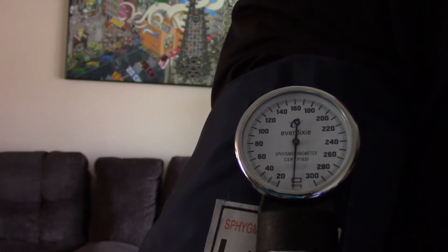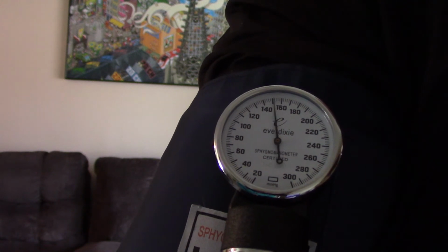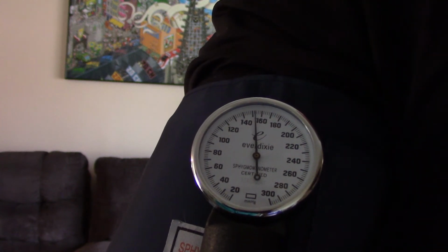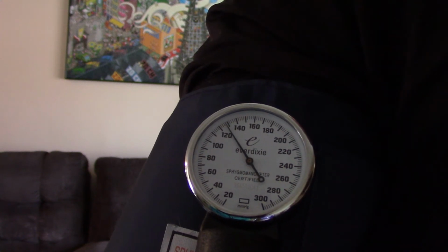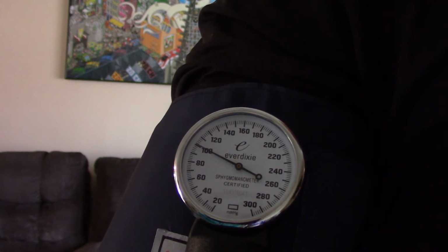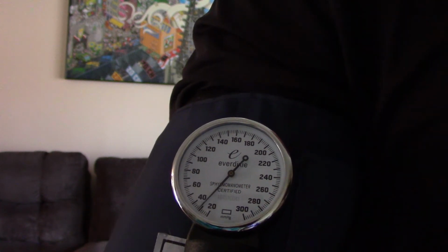Okay, so as you measure a blood pressure, one of the hardest things is to let the needle fall at the appropriate speed. So I'm going to demonstrate here how quickly you want that needle to fall. That speed right there is about perfect. So it's falling slow enough that you can still hear the heartbeats, but it's going fast enough that your patient is not increasingly going into too much pain. Once you've heard that last heartbeat, we'll say his last heartbeat I just heard right there, you want to open the gauge all the way to relieve the pressure.